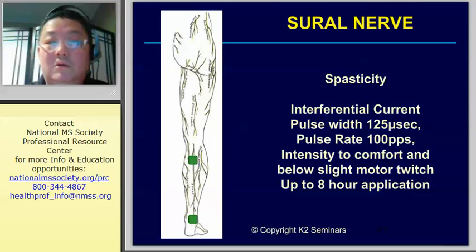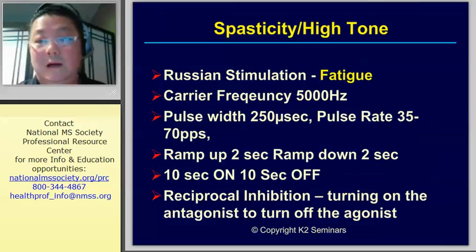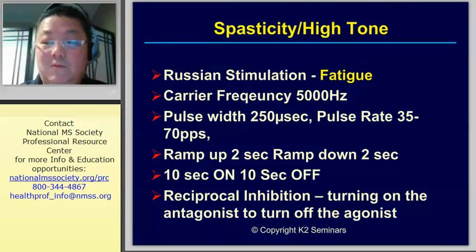Just need to make sure your lead wires are long enough so that it can run up the pants, so that you can use it without having to wait around for the treatment to occur at 8 hours. Bummer if you're stuck, right? No. So get them up and move them around.